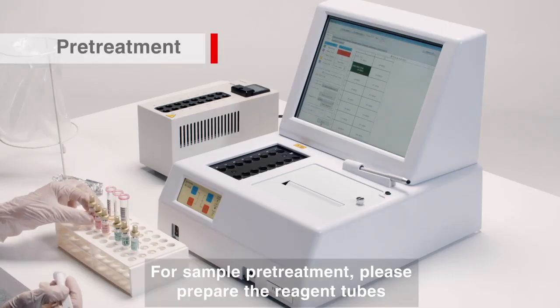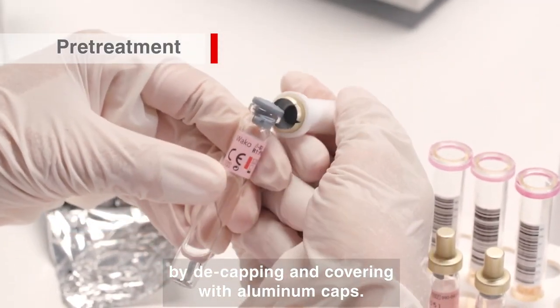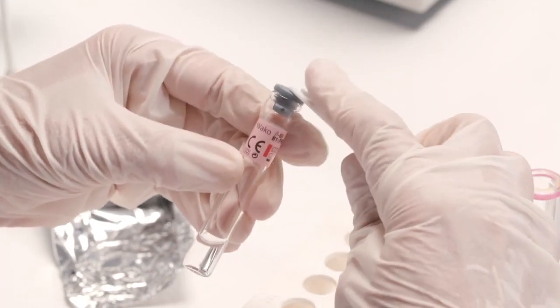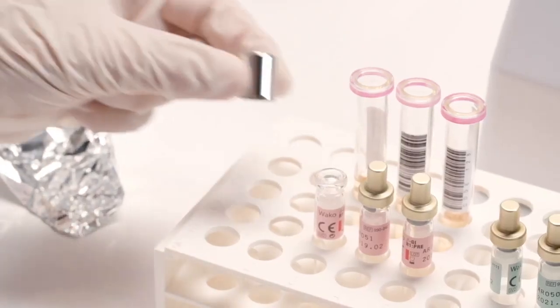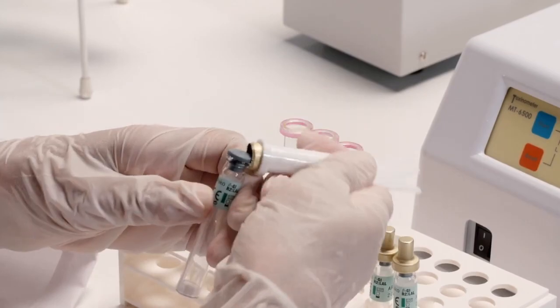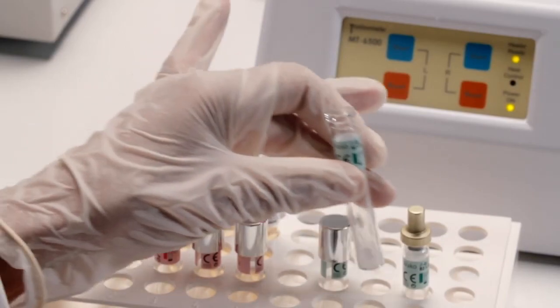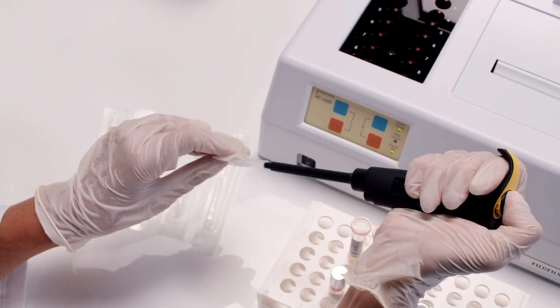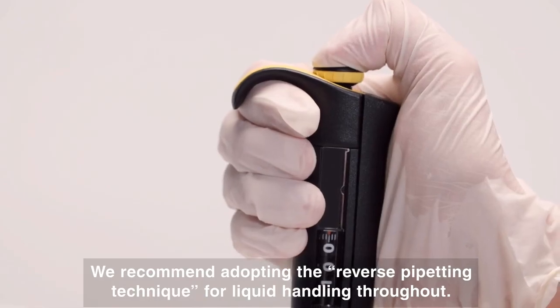For sample pre-treatment, please prepare the reagent tubes by decapping and covering with aluminium caps. We recommend adopting the reverse pipetting technique for liquid handling throughout.